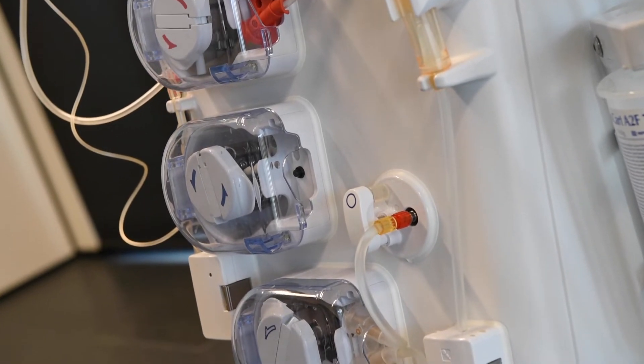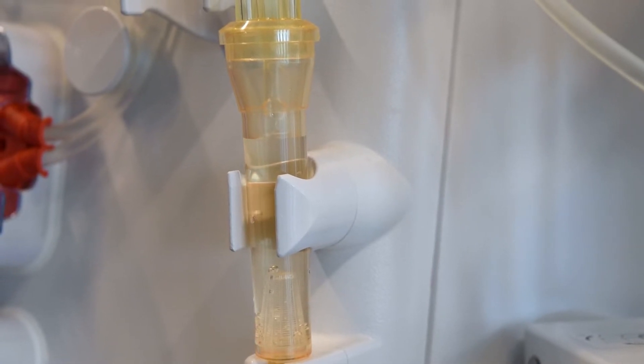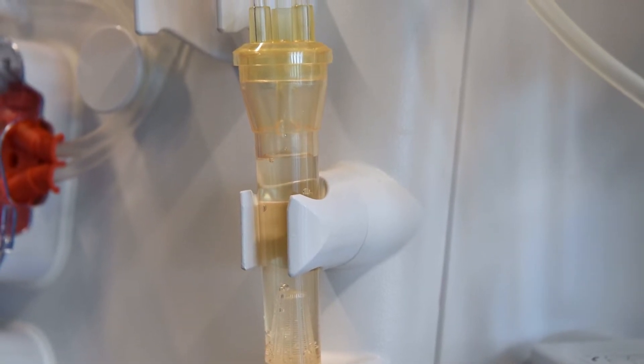The bloodline will automatically be filled. At the end of the priming process, the machine will set the venous chamber level using the last 50 ml of the priming volume.